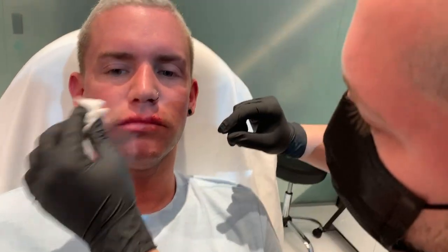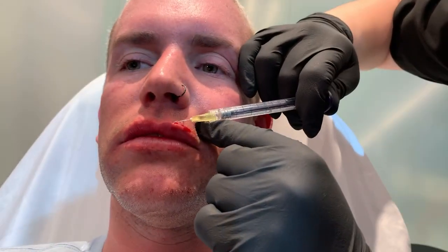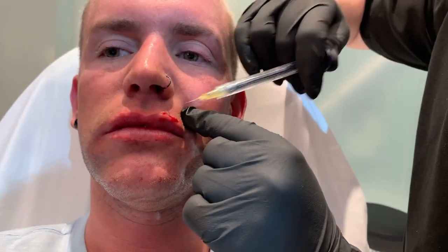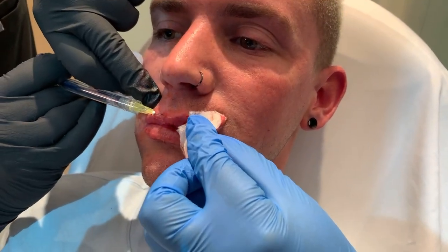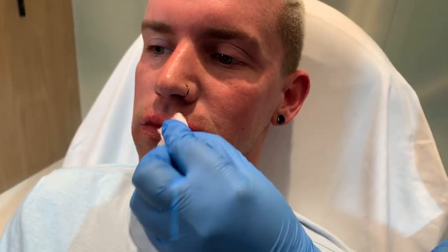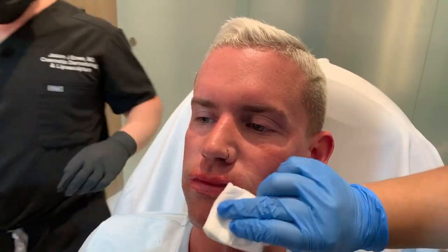A teeny bit if I need. Yeah, that looks much better. All right, so now last little bit, we're gonna go to the midline Cupid's bow, give it a little definition. Same thing on the other side. And I think that's good for a syringe. And we're gonna let it settle, and then we'll do a reveal really quickly. And I'll show you guys what one syringe can do.